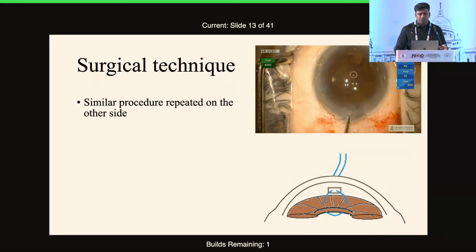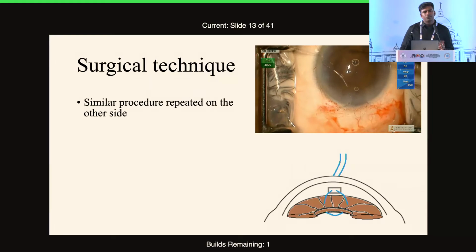Once both the sutures are there, you tie 3, 2, 1. And when you tie the suture, you do not crush the iris tissue. The iris tissue in between the two suture areas is going to be loose, so at the end of surgery you will see a small parabola of the suture. If you crush the iris tissue, you will have a very tight suture, and you are going to have tilting of the intraocular lens. We are trying to position the IOL at the PC level, as in regular in-the-bag positioning, so the IOL has to be a little bit loose. If your iris is crushing, make sure you loosen it up.